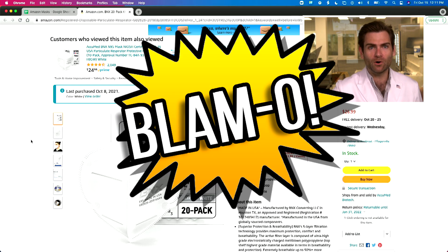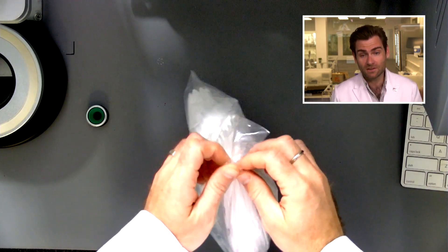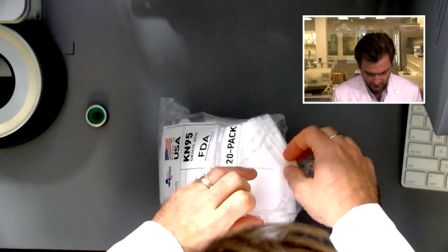Welcome back — we are testing every single mask on Amazon. Today we're looking at what I think might be an actual KN95 that is USA-made. I recently released a KN95 claiming to be the only USA-made one, and I think I was wrong. The good folks at BNX may have done it before me — and they're in Texas. I'm going to open up this bag and get it in the clamper.